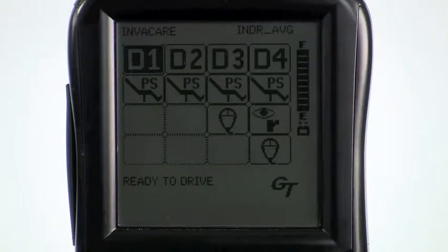The first option to change drives is on the display or driver control. Use either the toggle or drive select switch located on the driver control to change drives. Here on the standalone display, I'll use the right and left arrows.